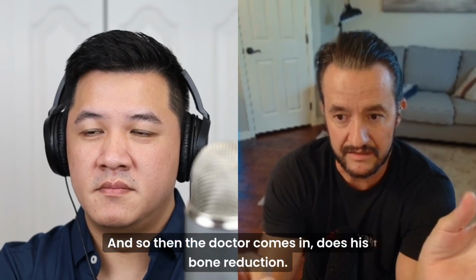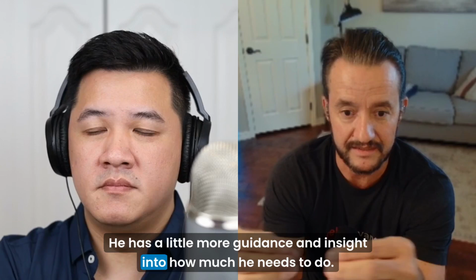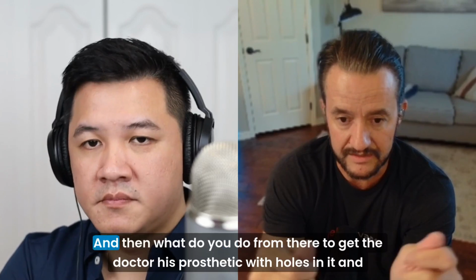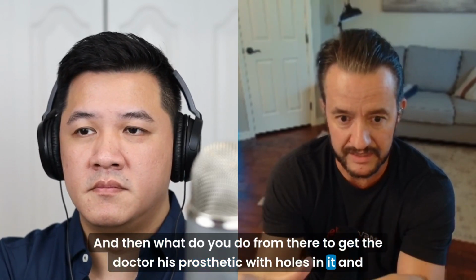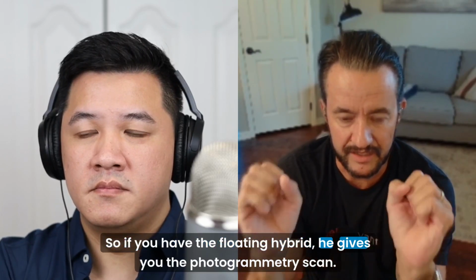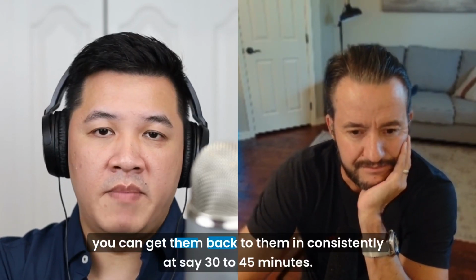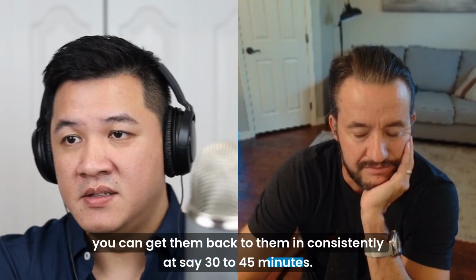And so then the doctor comes in and does his bone reduction. He has a little more guidance and insight into how much he needs to do. And then he's going to take the photogrammetry scans day of surgery to give you the coordinates. And then what do you do from there to get the doctor his prosthetic with holes in it? And how much time does that take? So if you have the floating hybrid and he gives you the photogrammetry scan, how quickly do you turn the design back to him for printing? You can get them back to them consistently in, I'd say, 30 to 45 minutes.